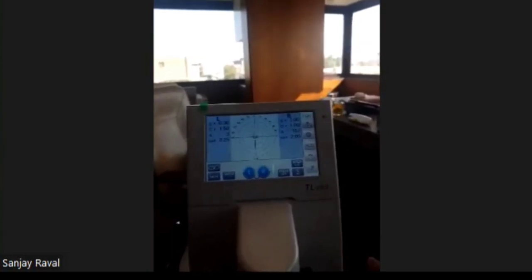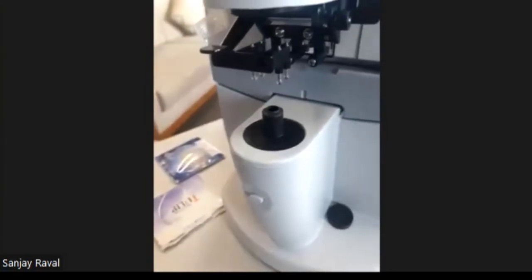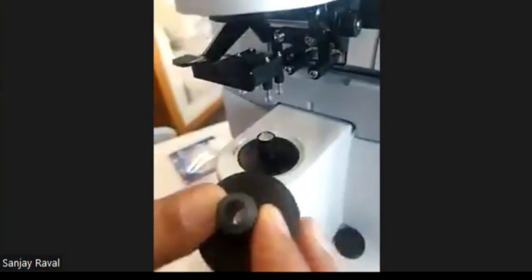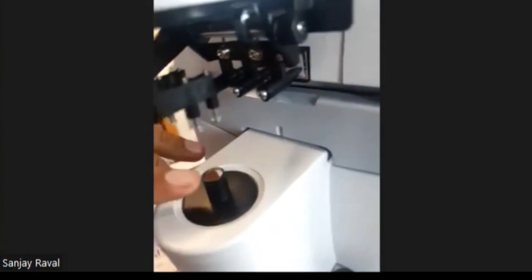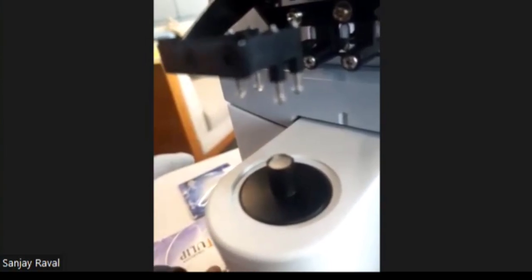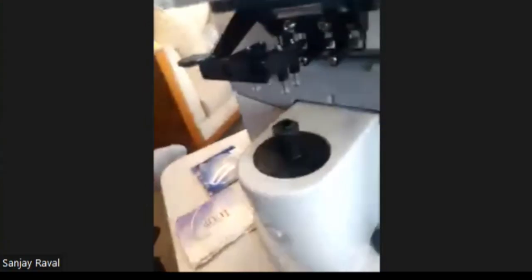Another thing, we get an optic error many times. Is it just because of dust or something else? Yeah, exactly. There is only one maintenance which has to be carried out at your place by your person. Since we are living in one of the dustiest parts of the world, there is a lot of dust. Just remove this lens cap and have a look at this glass. If you find settled dust, just clean it without any force. Wipe it with a soft cloth. That's it. I'm sure that your error will go. Thank you, sir.